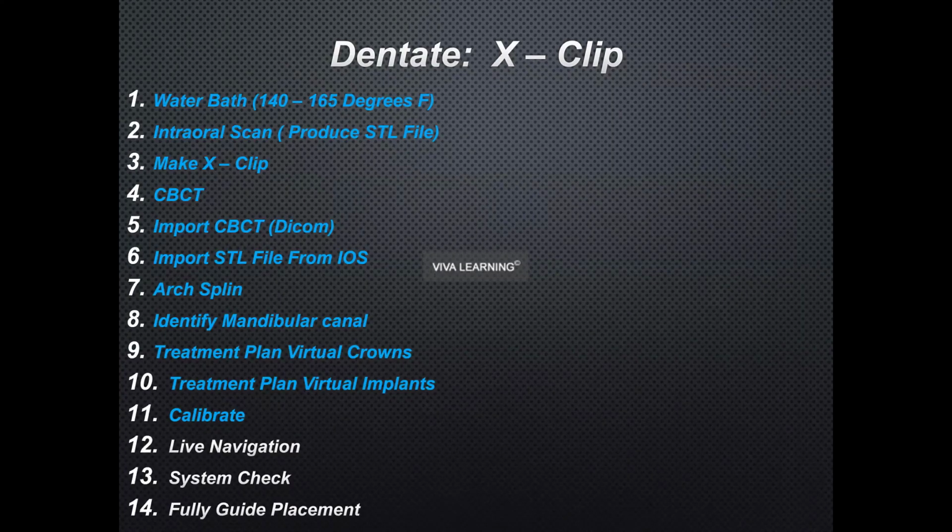A cool thing to notice here, I won't spend too much time on it, but those are things that we'll need to take, like a water bath or X-clip, intraoral scan, CBCT. As you look down through all those, the ones in the blue can be easily done by your assistant. So you give them guidance, they really get involved in this.